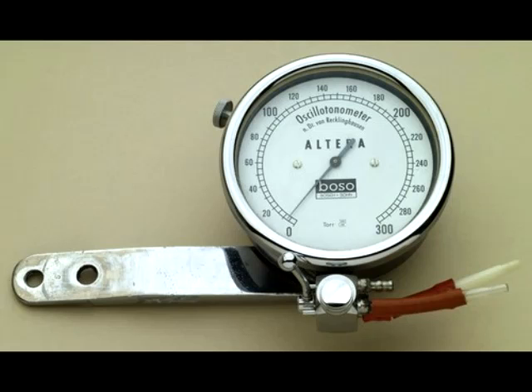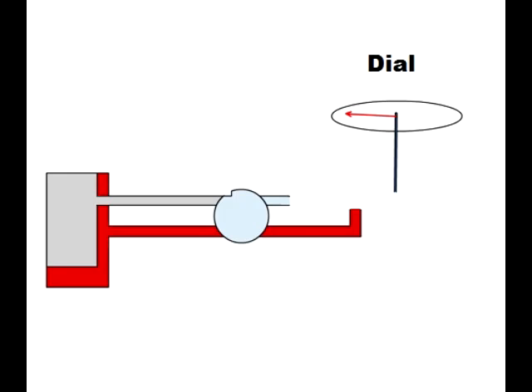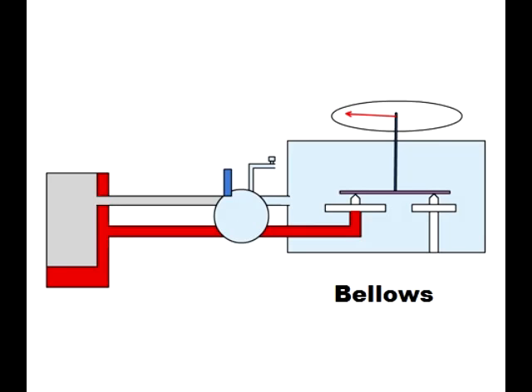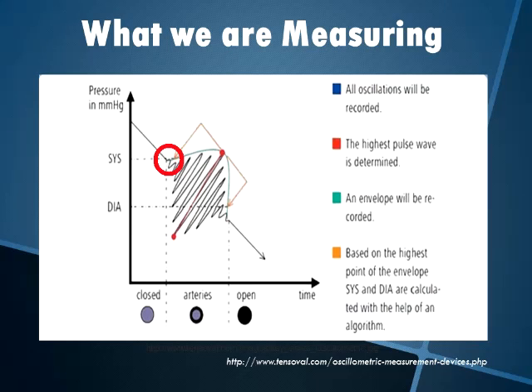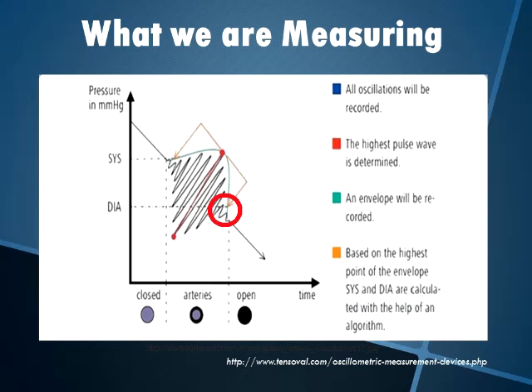While the first, larger cuff detects pressure like a normal sphygmomanometer, the second cuff amplifies the patient's pulse as the first cuff is inflated. As the pressure in the gauge drops, small jumps are seen in the needle. When the jumps become stronger, a dial on the cuff is triggered, causing the gauge to become fixed on a reading of systolic pressure. As the cuff continues to bleed, the instance of maximum deflection serves as a point of mean blood pressure, which is once again read by triggering the dial. Finally, when the amplitude of the jump suddenly begins to diminish, diastolic pressure can be measured.